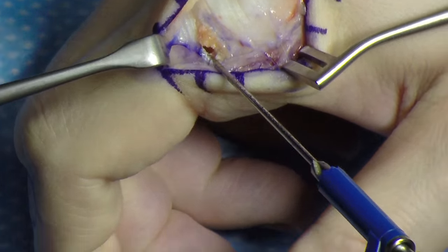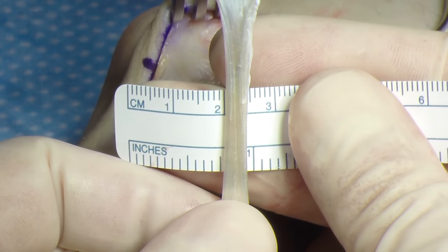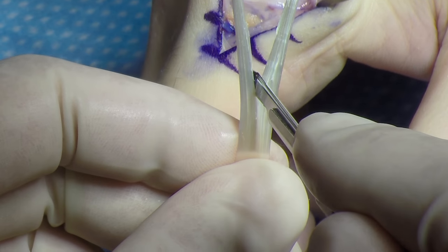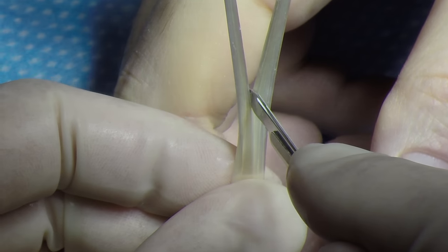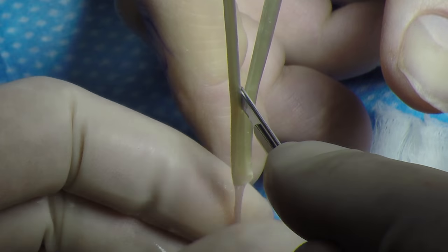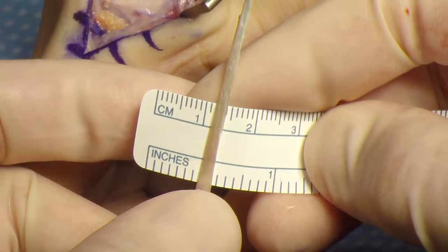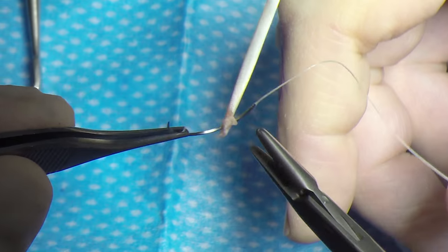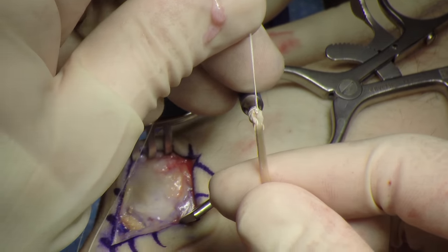A palmaris longus tendon graft was harvested. It's very important to keep the graft to a 2 millimeter graft — any larger and the anchors will not deploy. I do typically put a stitch at the end of the graft.